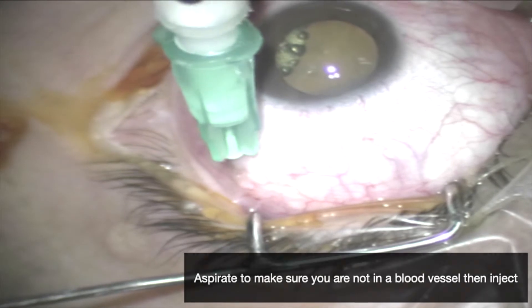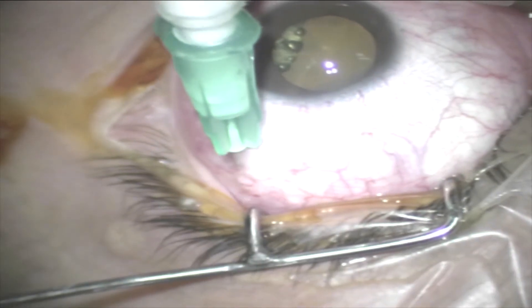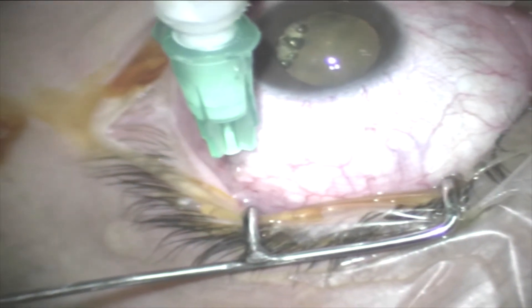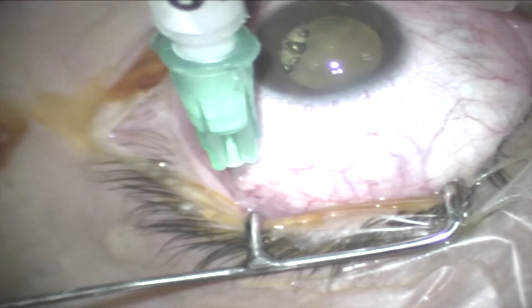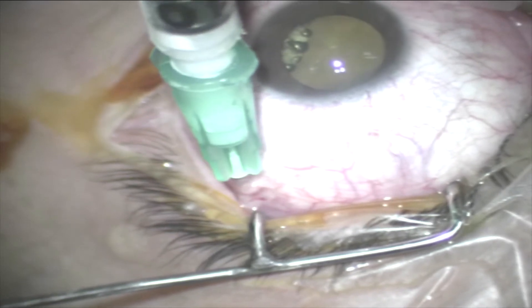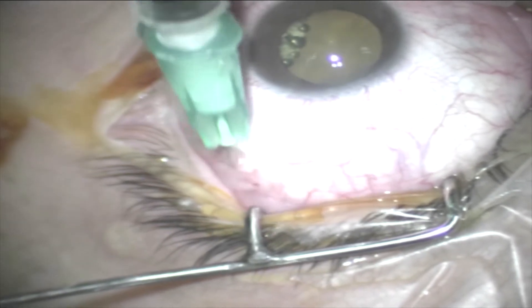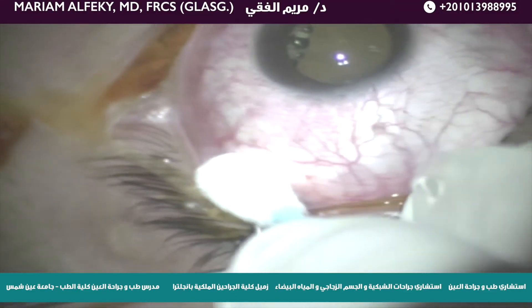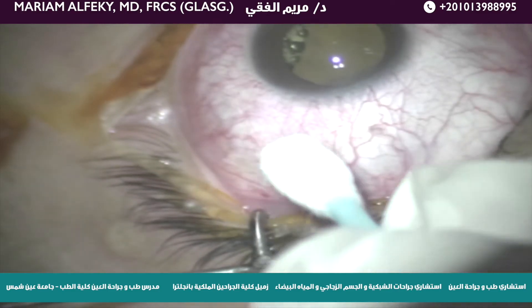Aspirate to make sure that you are not inside a blood vessel, and then inject slowly, making sure that the conjunctiva is not ballooning, so that you are injecting in the sub-Tenon's space and not the subconjunctival space.